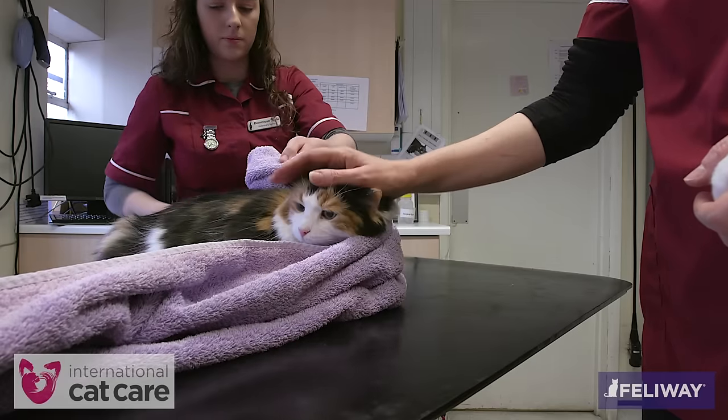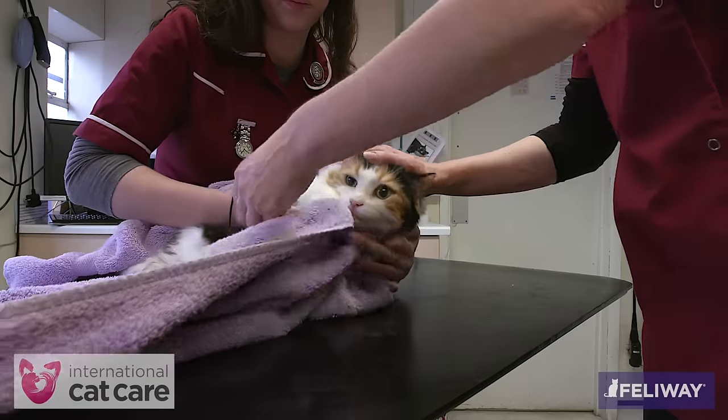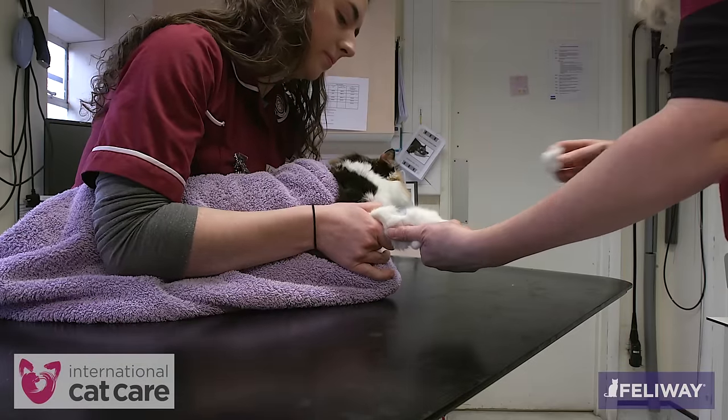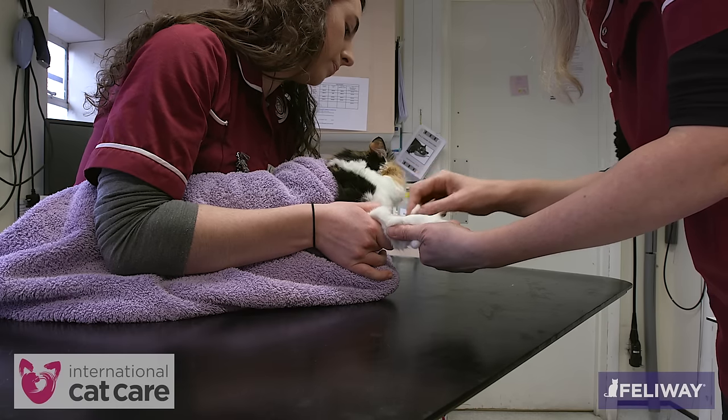If the cat is less cooperative, a towel can be used to wrap the cat, leaving out the limb to be catheterized. The assistant has a hand under the cat's head, her body is lowered towards the table, and her other hand used to extend the elbow and raise the vein.